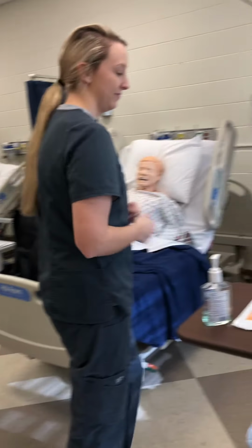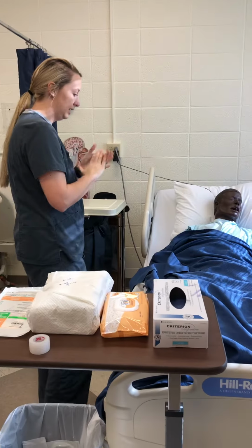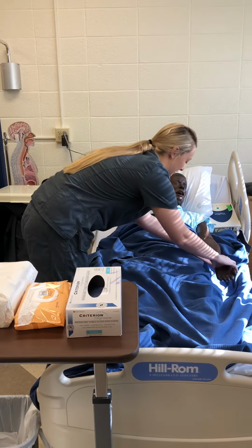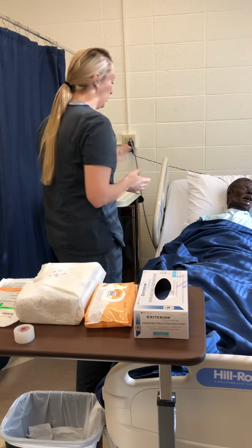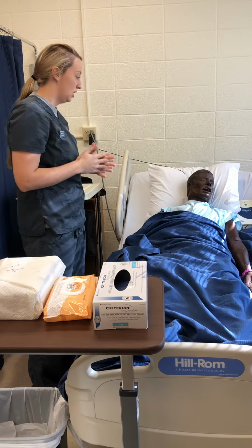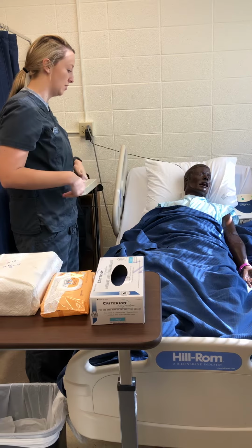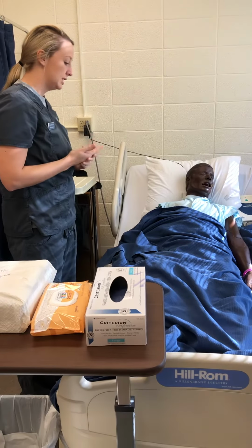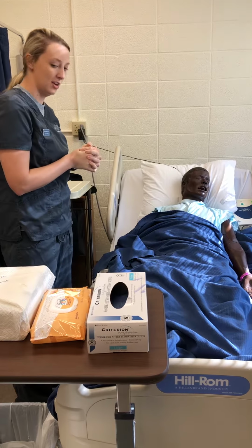Knock, knock, knock. How are you doing? My name is Cassie, and I'll be your nurse today. Can you tell me your name and date of birth? Awesome. So today we are going to be placing a Foley catheter. We're going to place this because you're going to be getting an epidural, and once you get the epidural, you'll lose sensation from your waist down, so you won't feel the urge to urinate. So I'm going to go ahead and place that, and it's a pretty fast procedure.